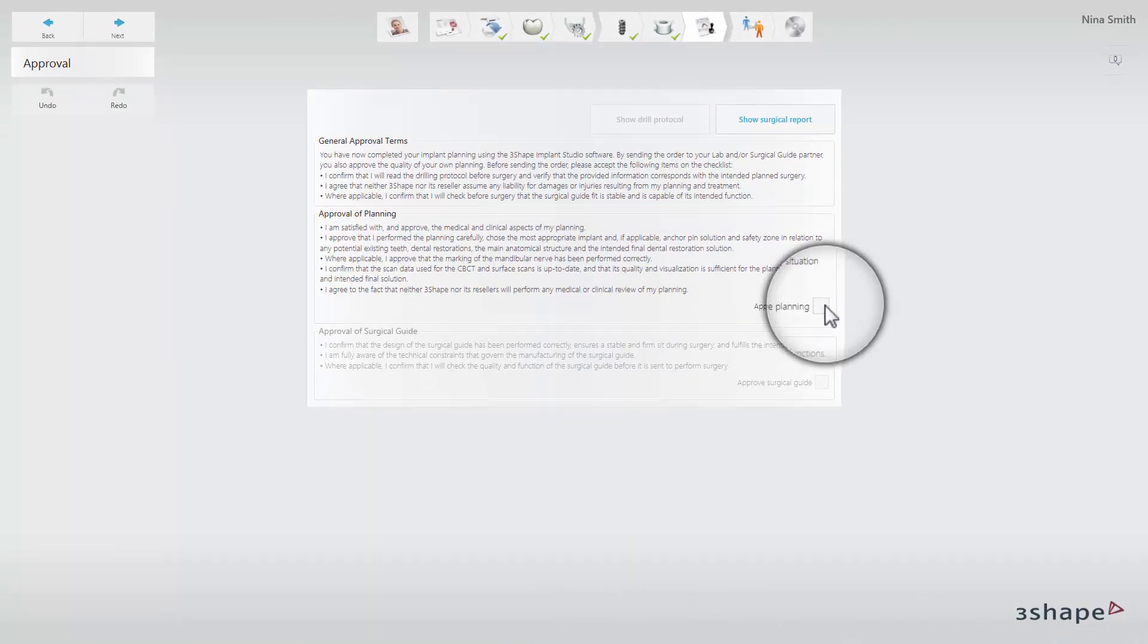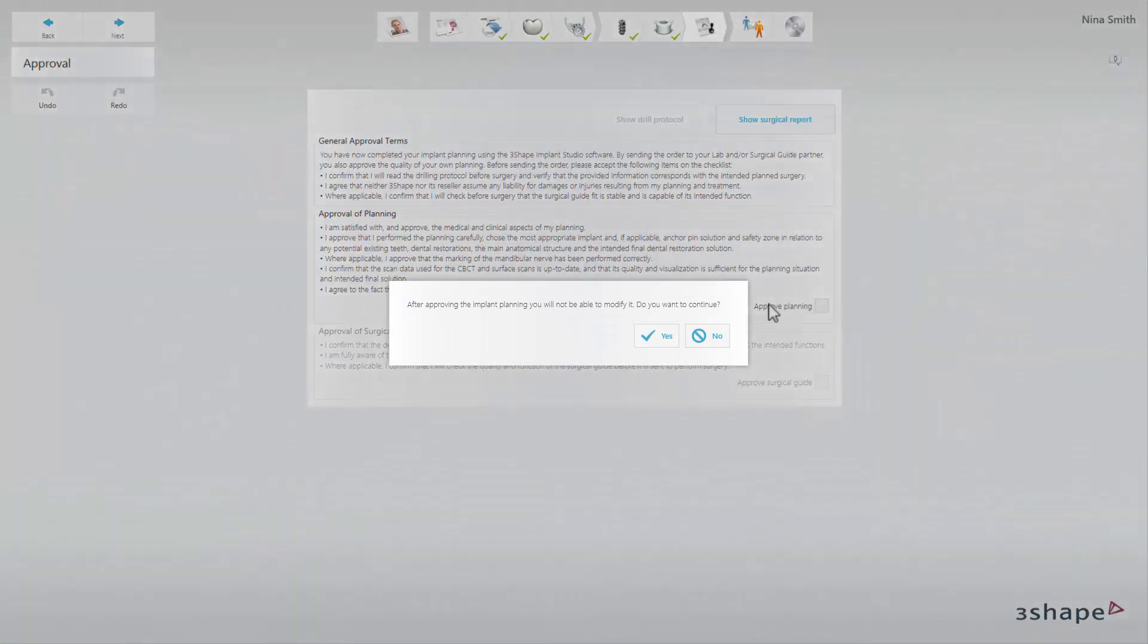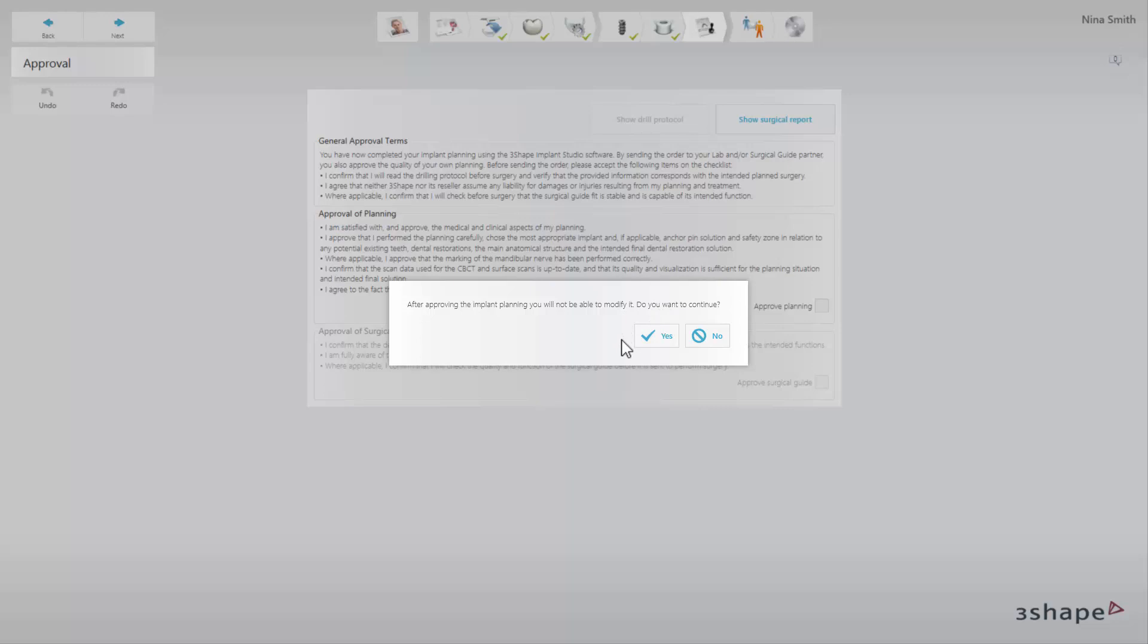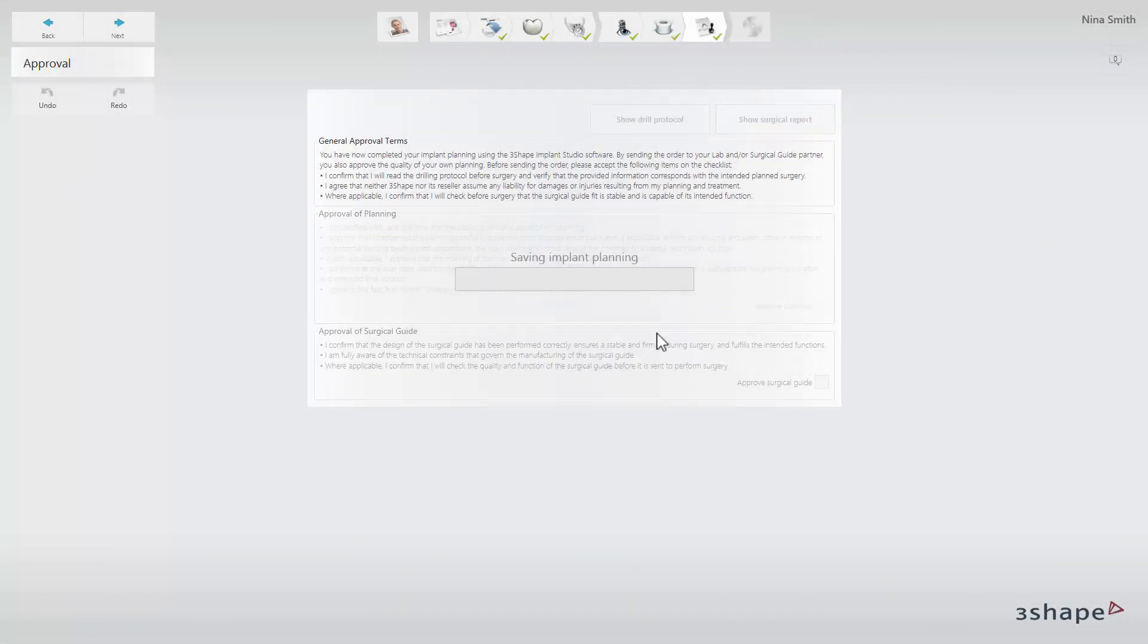By clicking the approval checkboxes, a warning message will appear informing you that after the approval you will not be able to edit the implant planning or surgical guide design. Click Yes to approve.